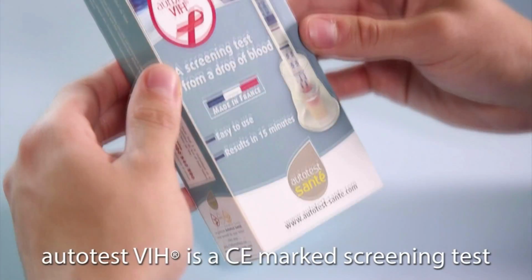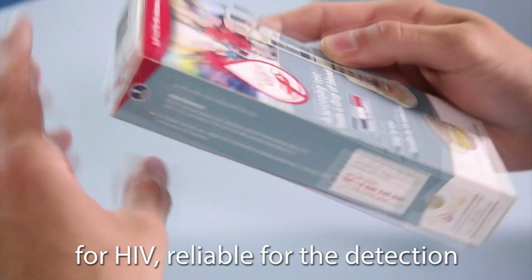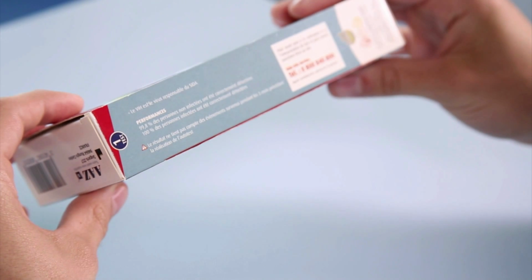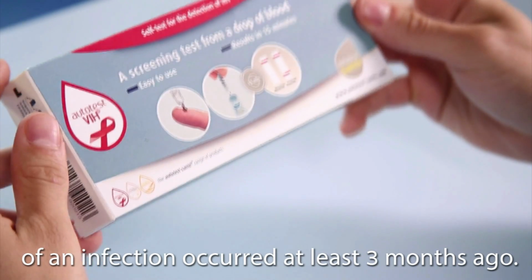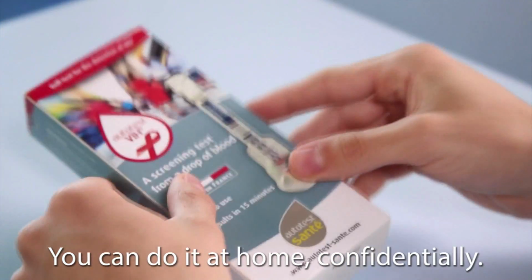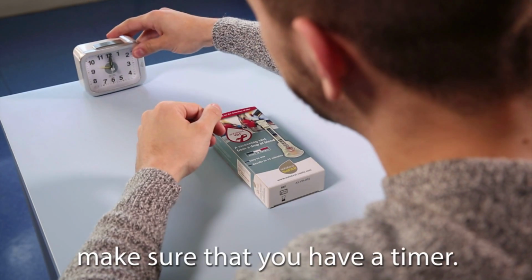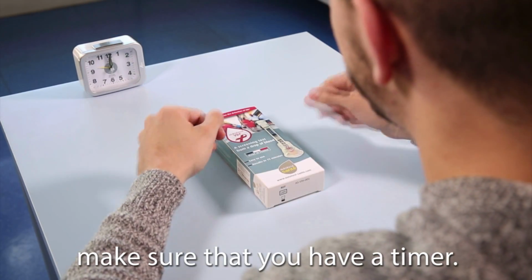Autotest VIH is a CE marked screening test for HIV, reliable for the detection of an infection occurred at least 3 months ago. You can do it at home, confidentially. Before starting the test, make sure that you have a timer.